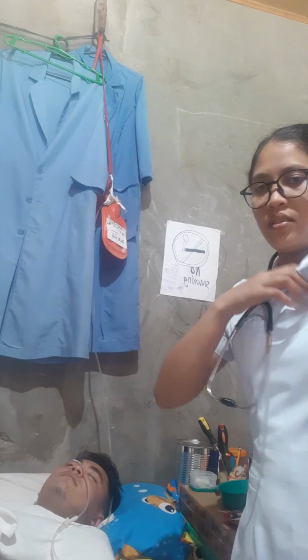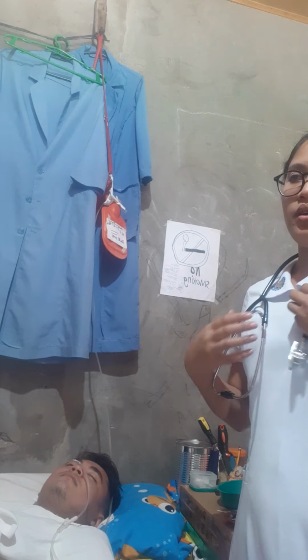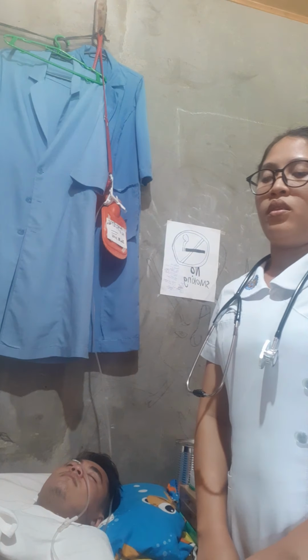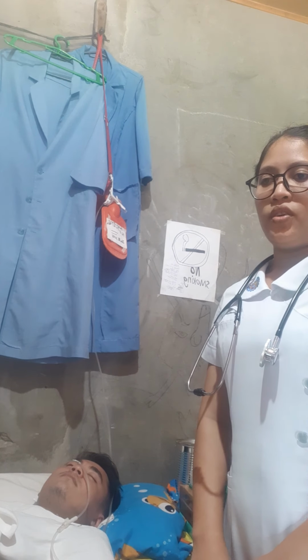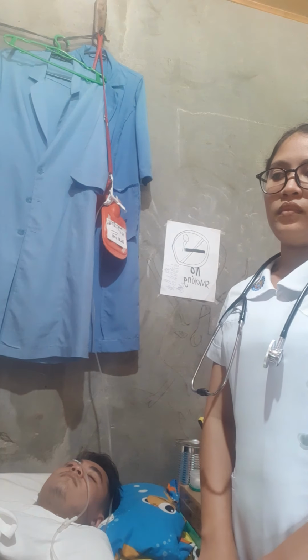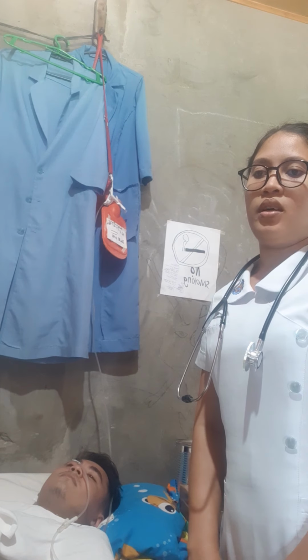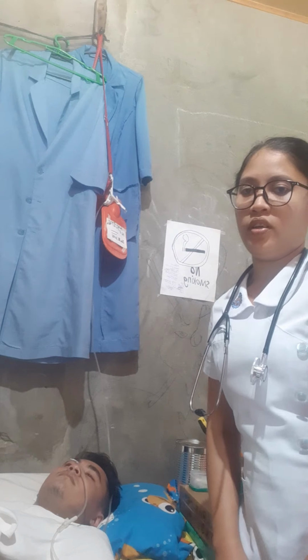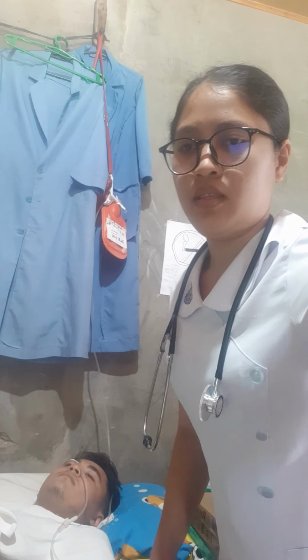Then afterwards, for documentation, document the feeding, including the amount and kind of solution taken, the duration of feeding and assessment of the client. Then record the volume of the feeding and water administered on the client's intake and output record. That's all. Thank you.